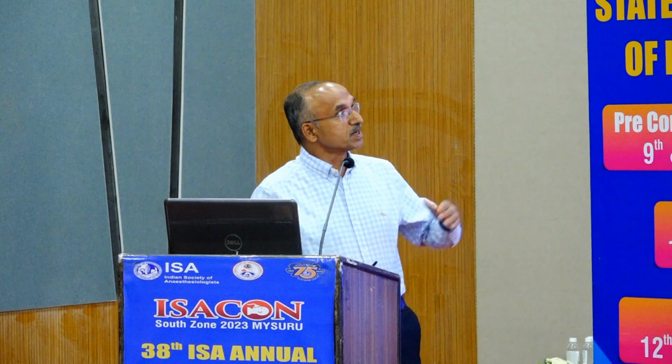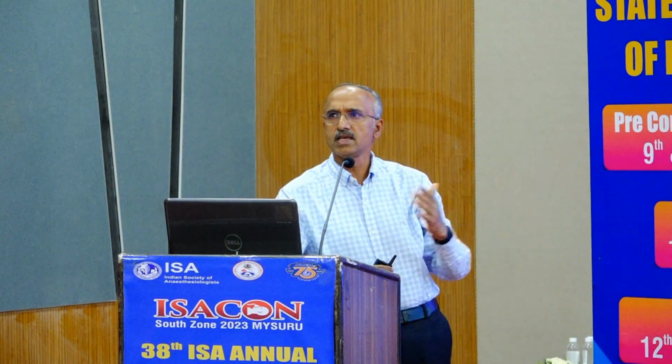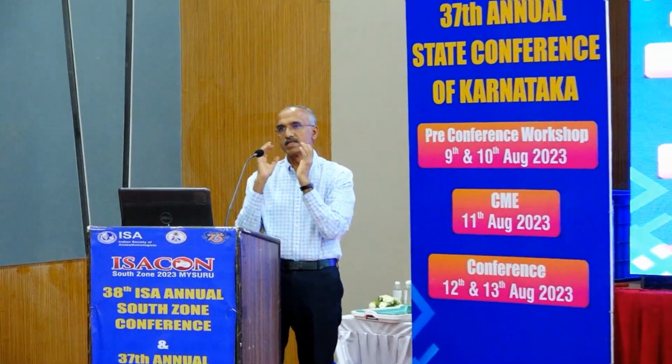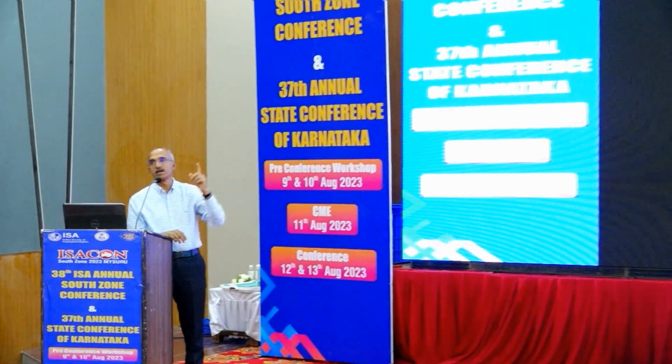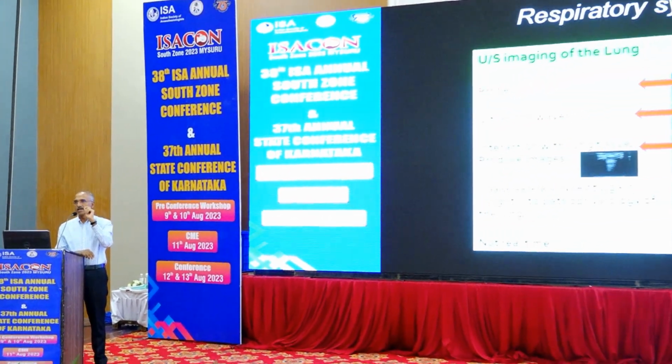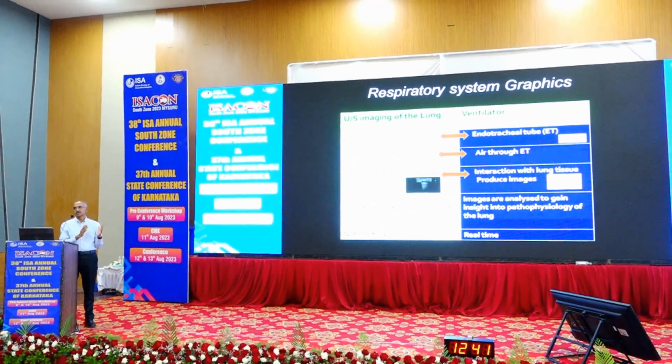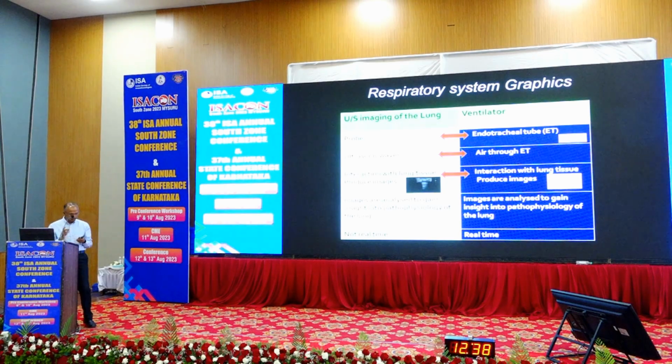If you compare lung ultrasound and ventilator graphics, the graphics are real time. You can see every minute whenever a tidal volume goes and interacts with the alveoli. When they interact, the output that you get is displayed as graphics. Every breath which is delivered interacts with the airways and the alveoli, and it's displayed on the ventilator. Minute to minute, there is an output, and you can analyze that and do the settings accordingly and see to it that the patient is in the lung protective zone.